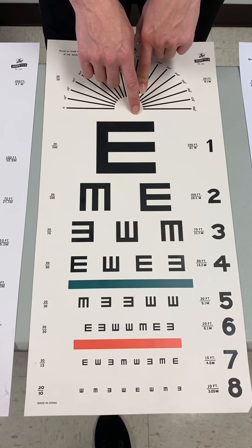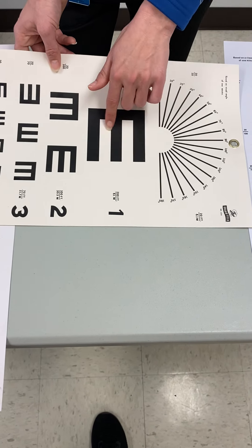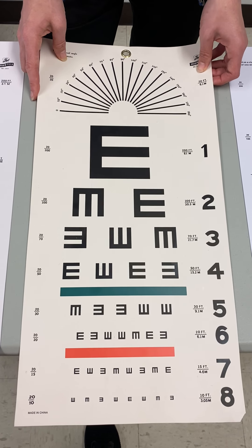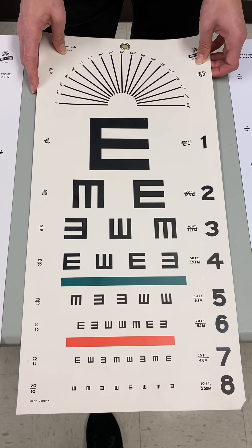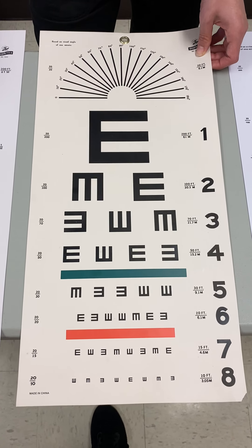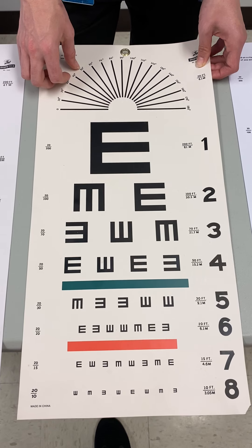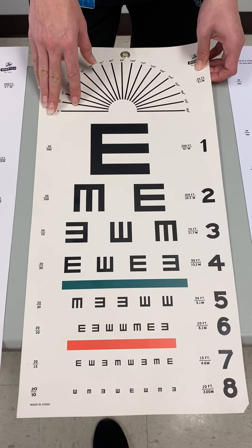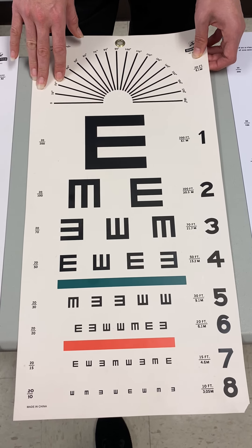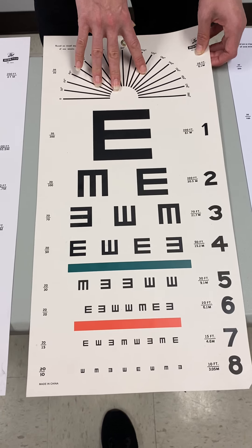With the Big E chart, you ask the patient to tell you which way the E is facing. The easiest way to ensure they understand is to compare it to a table with legs, and ask which way the legs are facing. For children especially, I'd suggest playing a game first — draw the letter E in the same box format on an index card, show it to the child, ask which way it's facing, and turn it in various directions until you're sure they understand, so you can get accurate results.